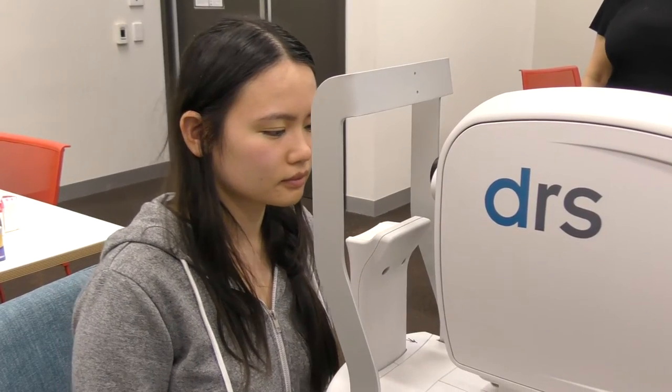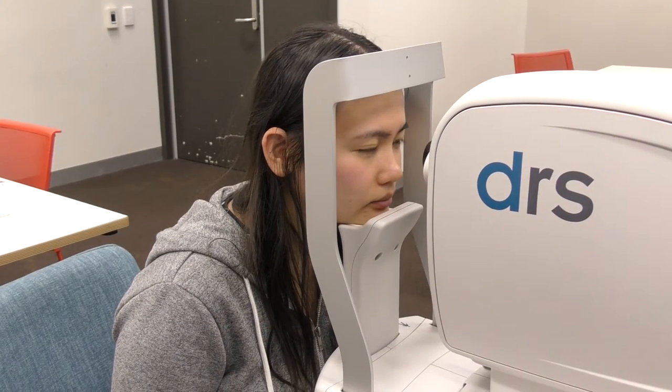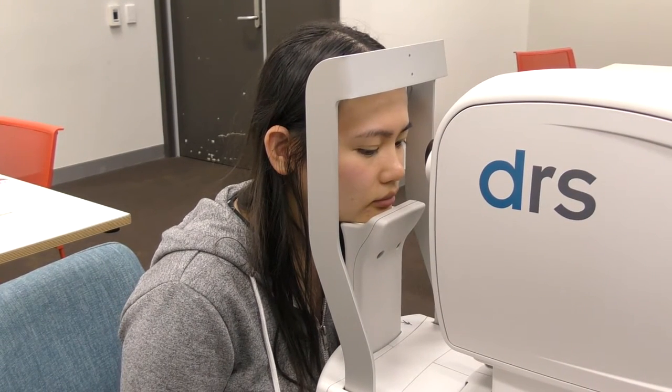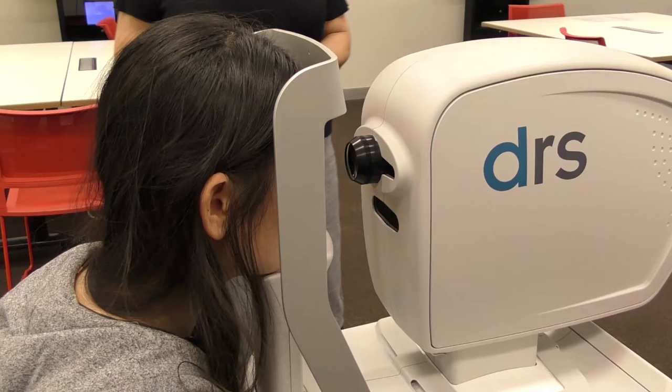There's a chin rest that she'll place her chin on. That chin rest is also a button, so the camera can't work unless you press down on it. There's also a metal bar across your forehead — press your forehead against it to orient your head in the right position for the camera lens to find your eyes.